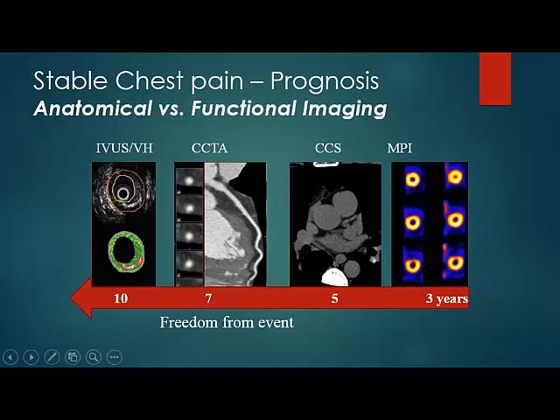If you take something like calcium scoring, a negative, absent calcium score means there is no calcified plaque. But it doesn't mean there are no soft plaques. There may still be soft plaques. So it is better than stress imaging techniques, but less better than something like CT angiogram, which shows us not only the lumen, but also the plaque in the wall of the coronary arteries. So to me, that's increasing benefit, you can say, or increasing warranty you get from techniques as you go further from stress to anatomical imaging. Does it make sense, this slide?